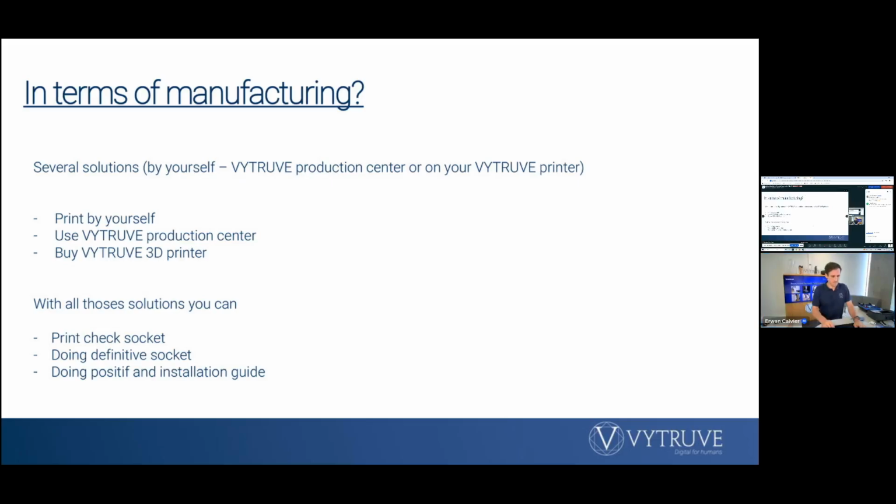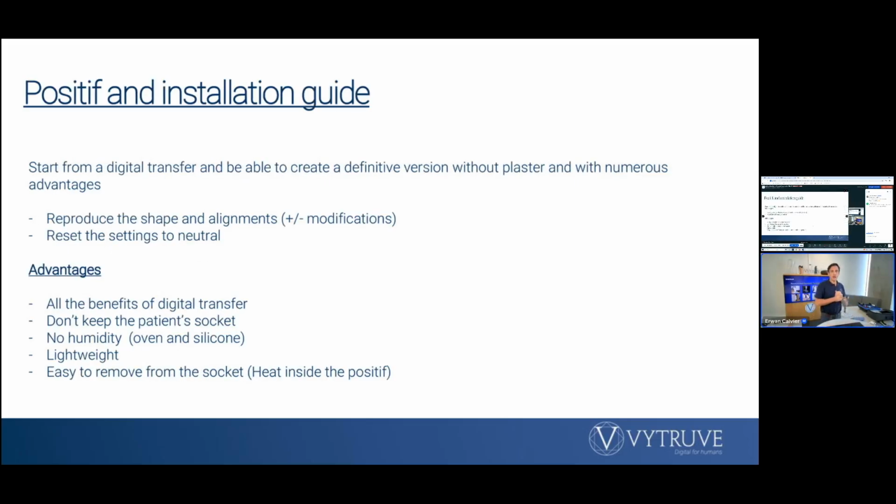So now I will come back to the presentation. So I talked to you about the positive and installation guide. So what is it? When you start a digital transfer, it's necessary after to transfer these files to a real socket. For this, we have designed positive and installation guide, and this is the positive and installation guide.